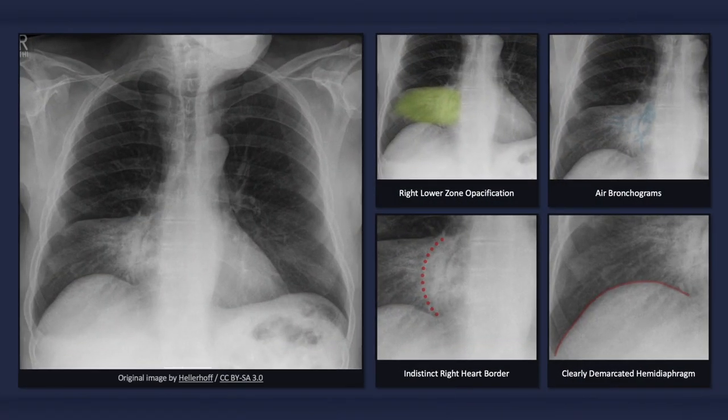To quickly recap, on an X-ray depicting right middle lobe pneumonia, we would expect to see right lower zone opacification with air bronchograms, and an indistinct right heart border but with a clearly demarcated right hemidiaphragm. Unless there is coinciding atelectasis, there is usually no loss of lung volume.